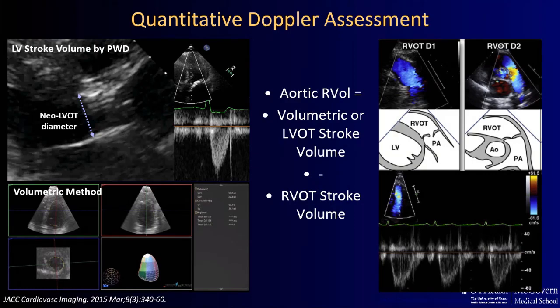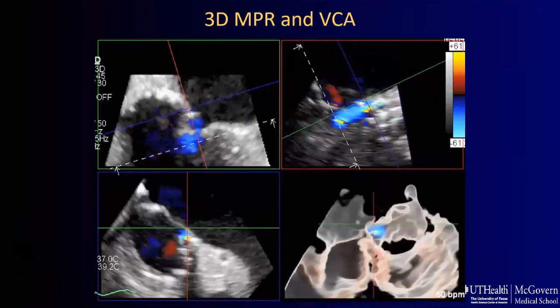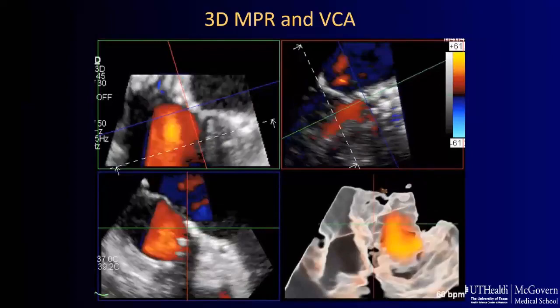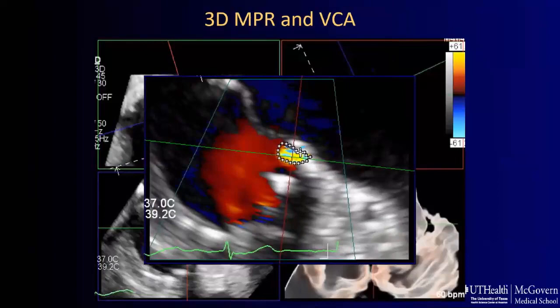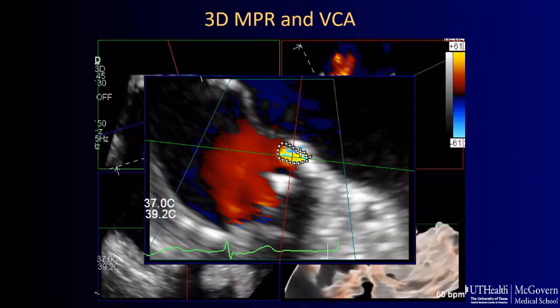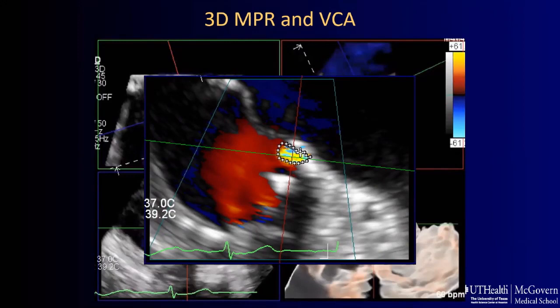A very useful method is 3D MPR for assessment of the vena contracta area. We align the planes with the jet and measure the area, which correlates much better with regurgitation volume than the vena contracta width. If the jet is very elongated and wrapping around the LVOT, measuring the width on its narrower portion would significantly underestimate the jet size, and measuring the widest portion would overestimate it.